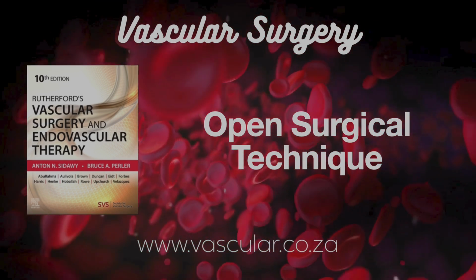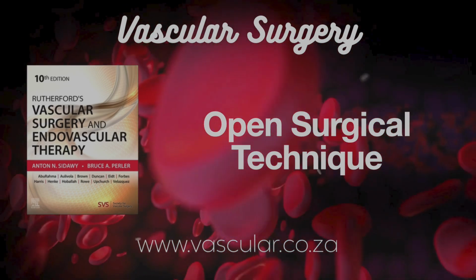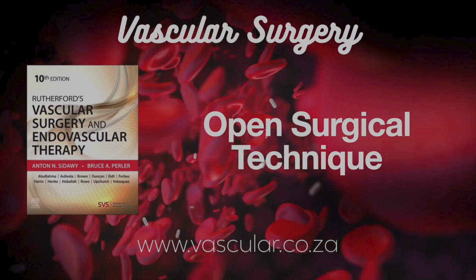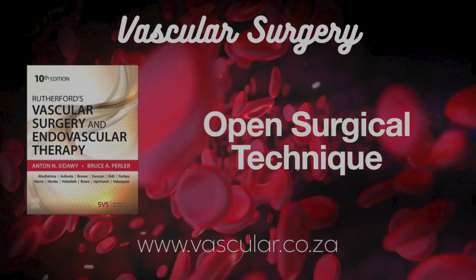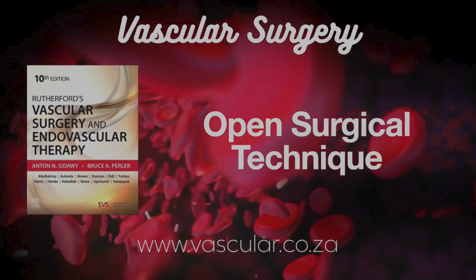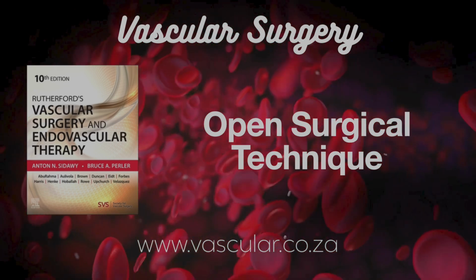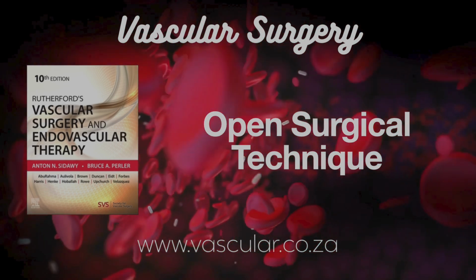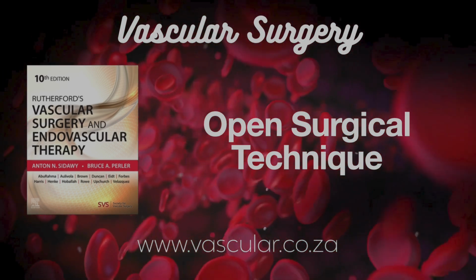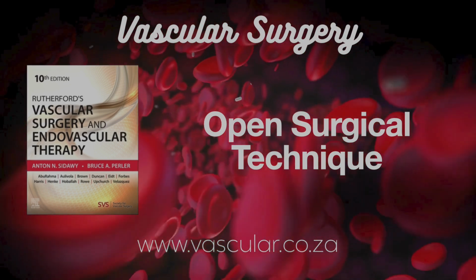That helps position the clamp in the safest way. So there isn't just one type of clamp? Oh, no, there's a whole range. Different shapes, different angulations, all designed for specific anatomical locations and different vessel sizes. And you have clamps that completely block flow versus those that only partially block it, side-biting clamps. Plus, for delicate artificial grafts, there are special clamps with soft atraumatic inserts, cushioned jaws, basically, to avoid damaging the graft. And for the really tiny vessels, think branches or vessels in the brain, we use even smaller, more delicate things like bulldog clamps or aneurysm clips.